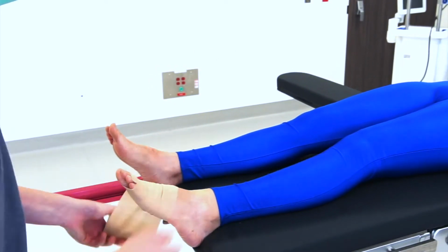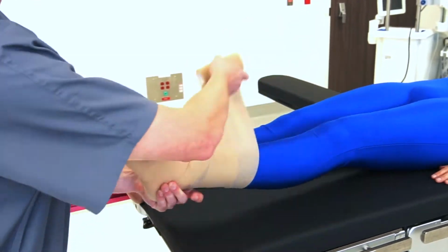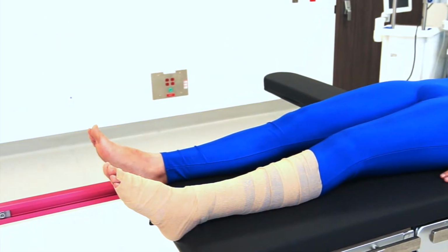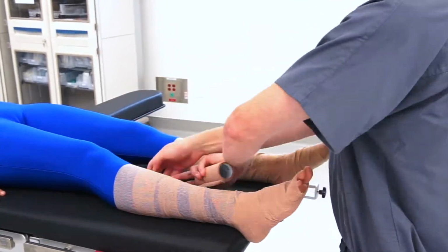Wrap the patient's leg with Coban from the foot to the upper shin. Ensure to wrap far enough up the leg so the traction boot will not directly contact the patient's skin. Repeat this process for the other leg. Ensure the Coban is evenly wrapped.